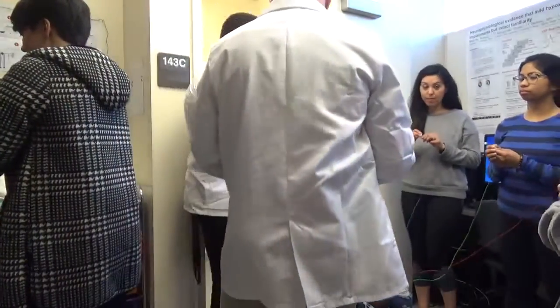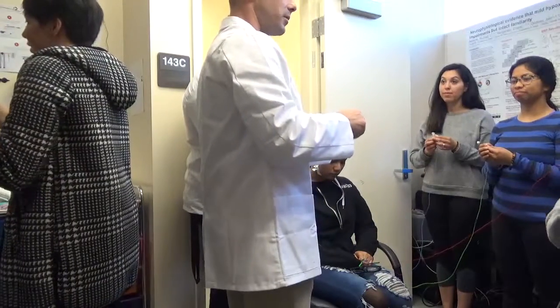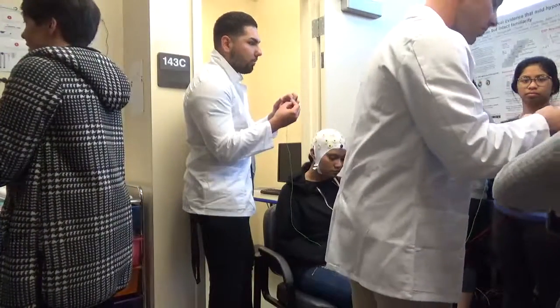So just try to line it up with the hole on the electrode. Just offset the tab a little so it doesn't line up with the wire.